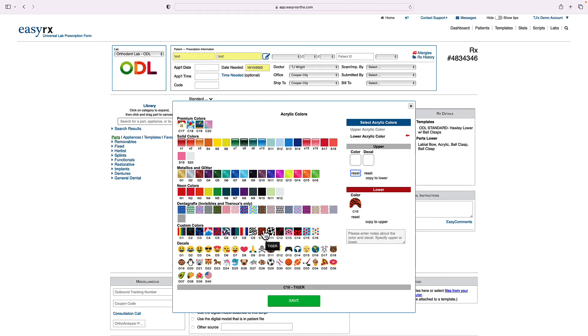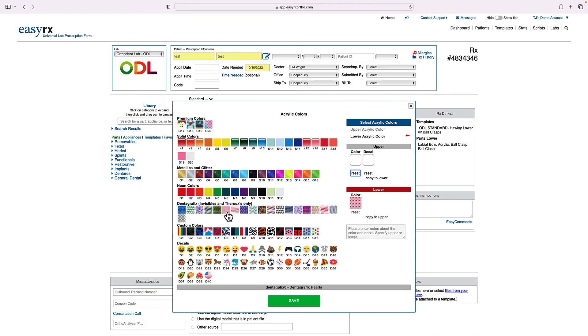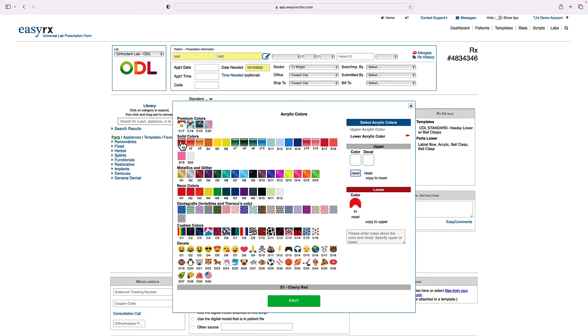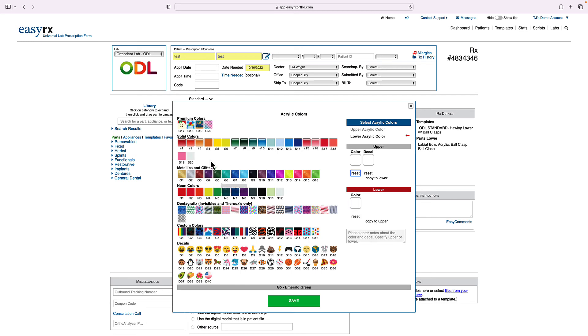You'll receive color charts that you can use to present to the patient so that they can choose the color they want. And we have two different color charts. We have one that has just the solid colors, which are the base price. And we have one that has everything. And those include the premium acrylics that are a little bit more labor intensive and thus cost a little bit more.